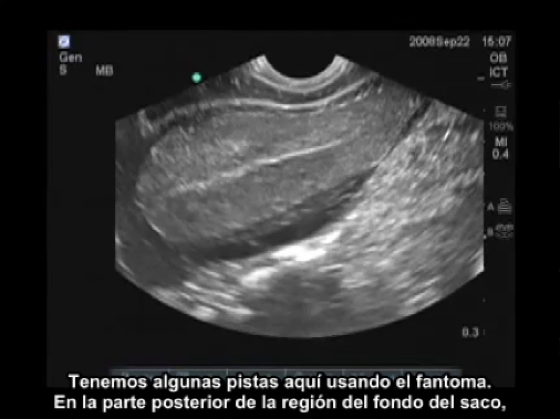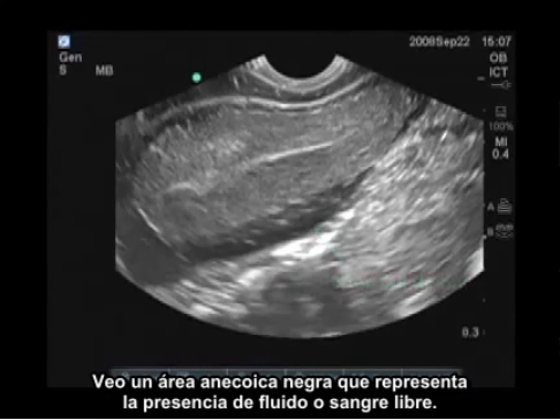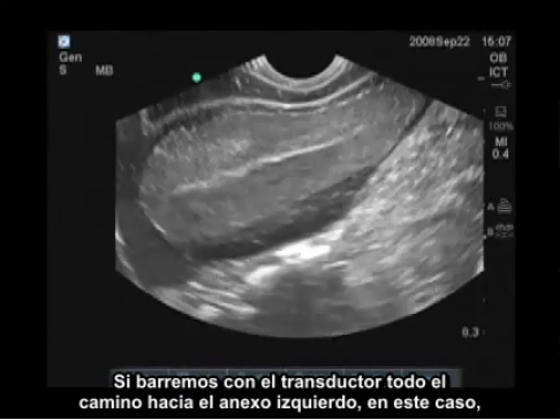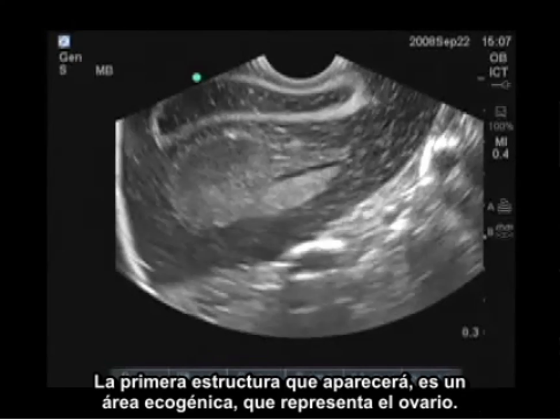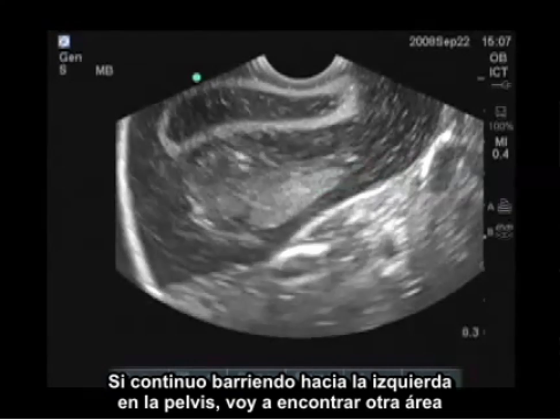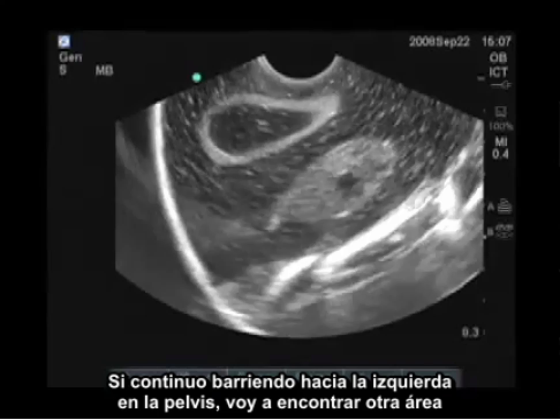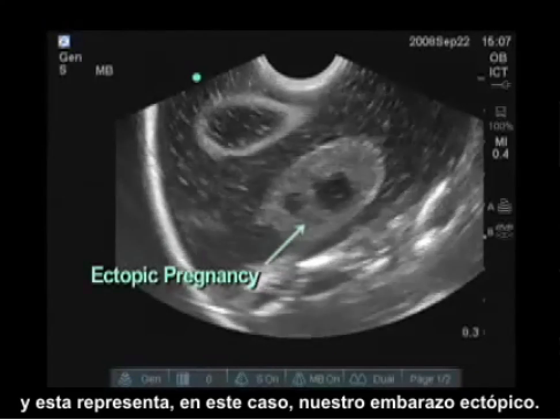I'm suspecting it's extrauterine or an ectopic pregnancy. In the posterior cul-de-sac region, I'm seeing a black anechoic area which represents free fluid or blood. Scanning all the way over to the left adnexa, the first structure I come across — this echogenic area — represents the ovary. Continuing to scan further left in the pelvis, I encounter another area.